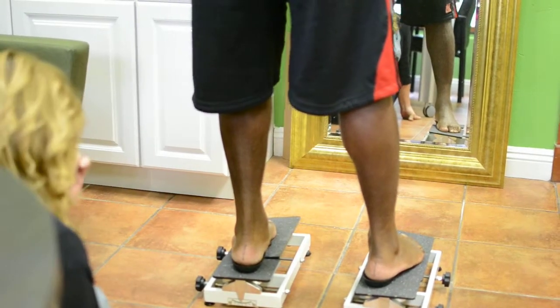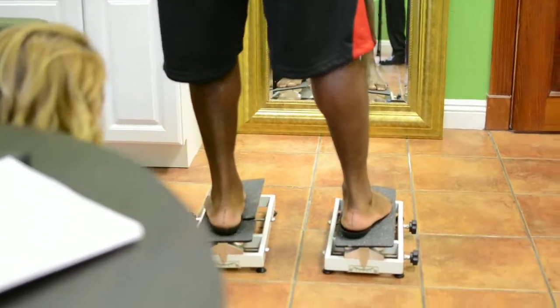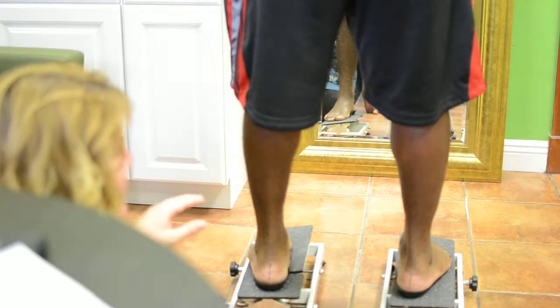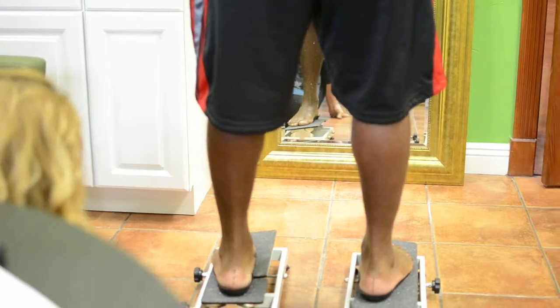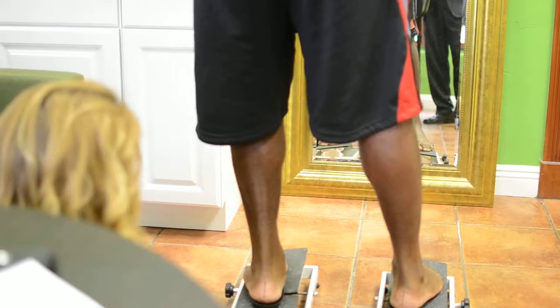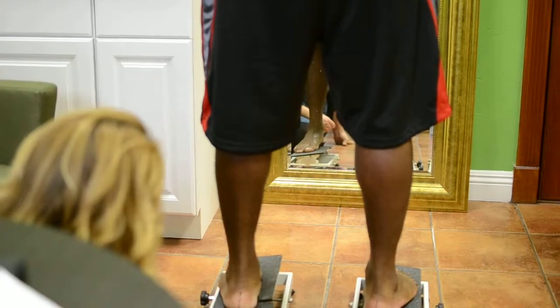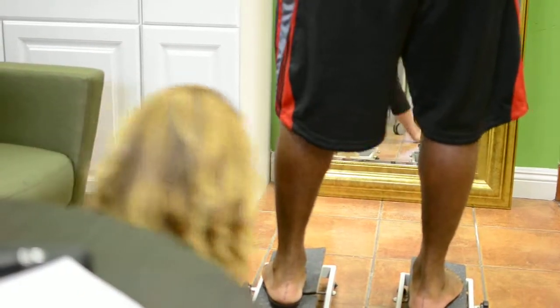The foot structure — other than the mobility you can get through manual manipulation — is what it is. It's not going to change, so we've got to start working with it. He can blame his dad or grandpa — genetics are genetics. Come on in — tell him what we're doing, he'll appreciate it as another football player. Let's come back up on the table, lay on your stomach.